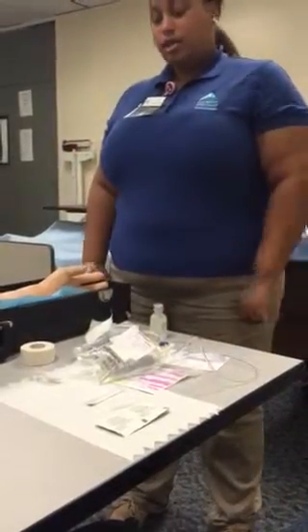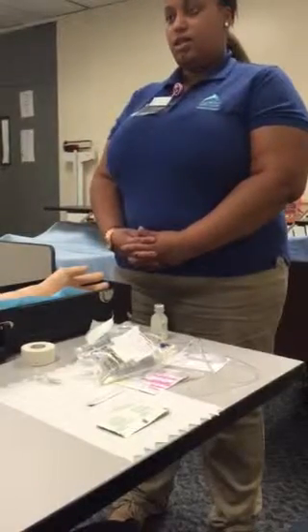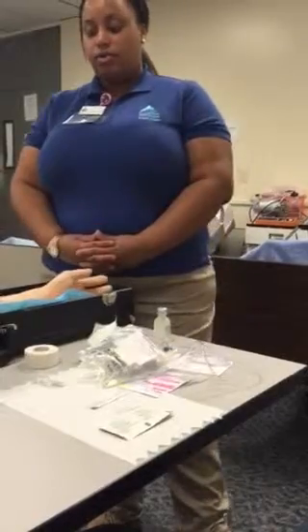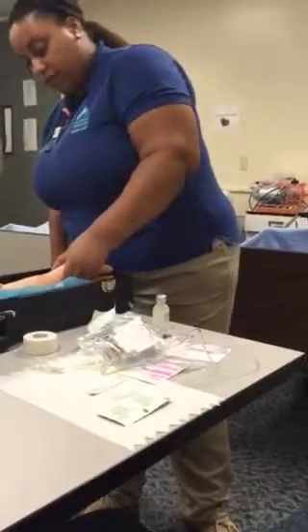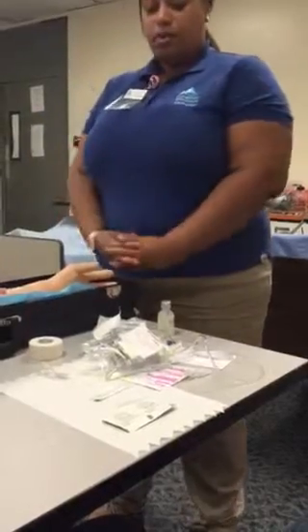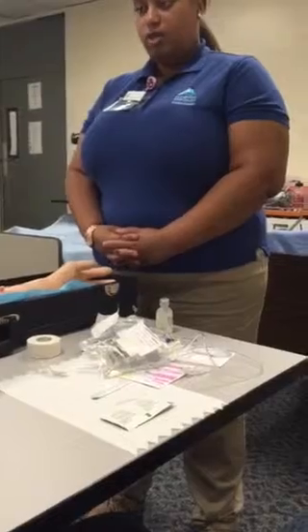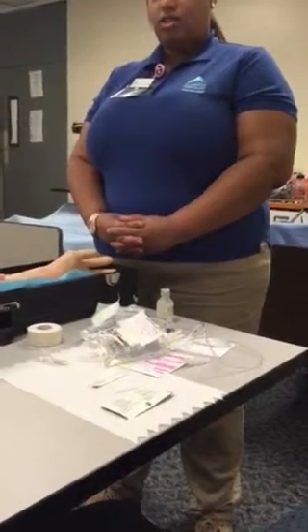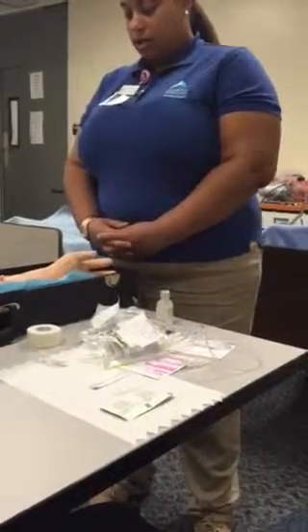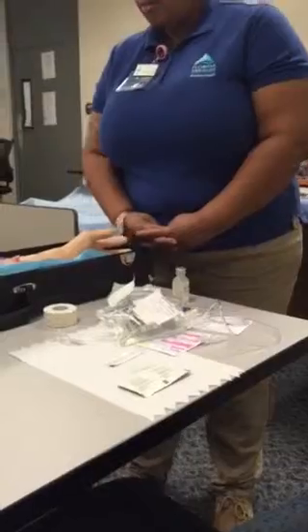Hi, Mrs. Smith. It's Yuntrell. I'm coming in to give you some IV antibiotics today that the doctor's ordered. Can you first just let me know your name and date of birth? Okay, Mrs. Smith, I'm verifying that with your name band and against my MAR. I'm going to make sure, do you have any allergies? Okay, I'm going to be giving you Rocephin. Do you have any allergy to that? No. Okay, well, good.